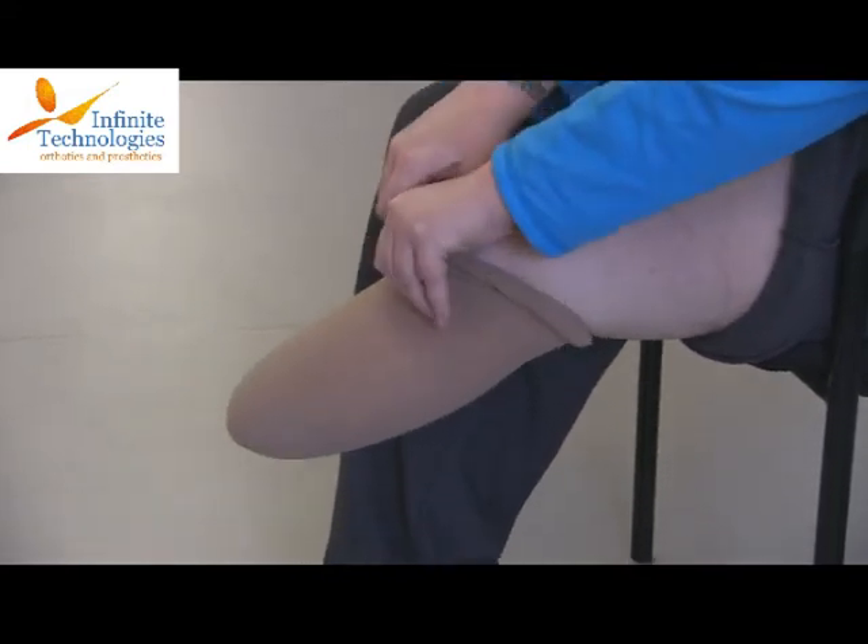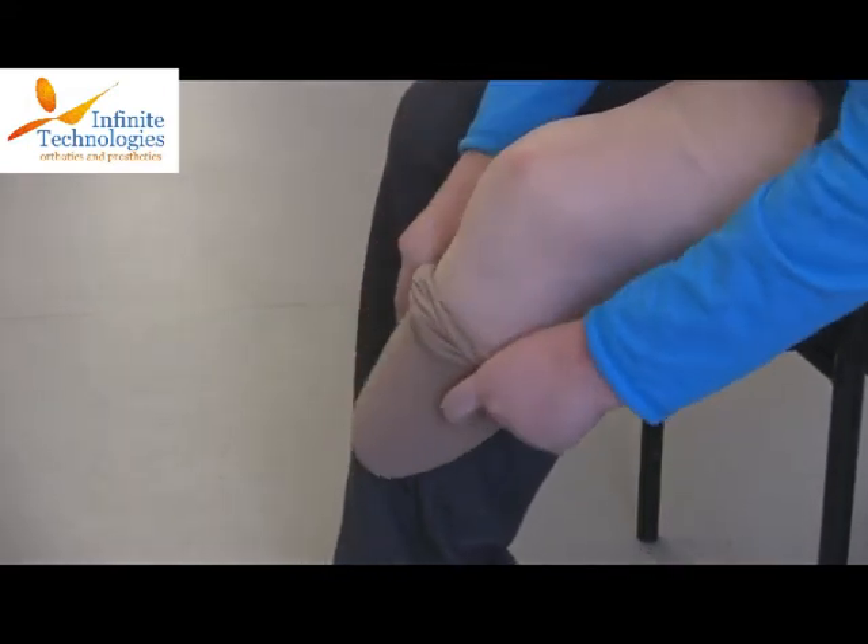To remove the shrinker, the proximal edge is grabbed on opposite sides and the shrinker is pulled off the limb.